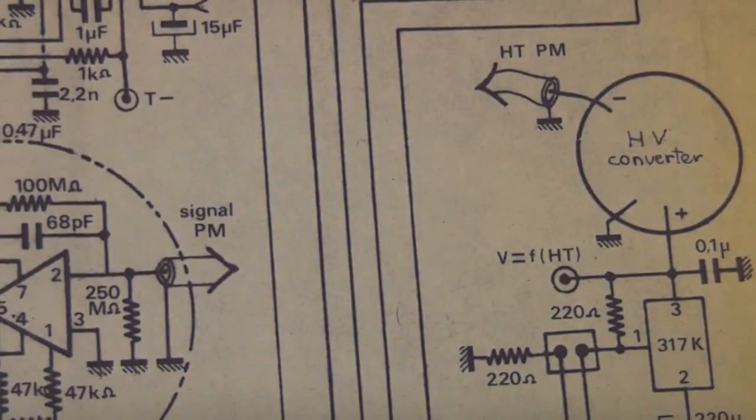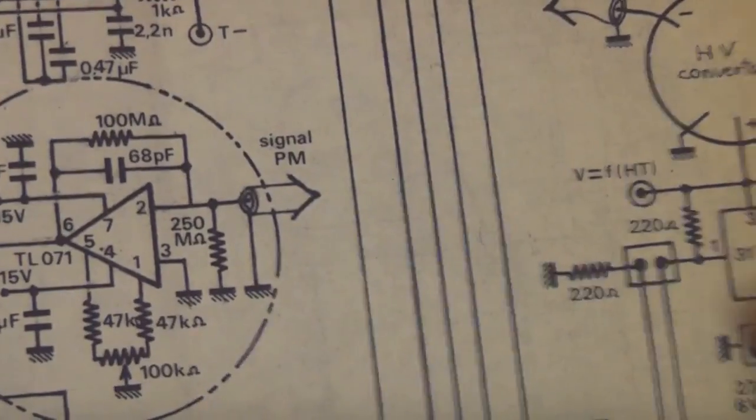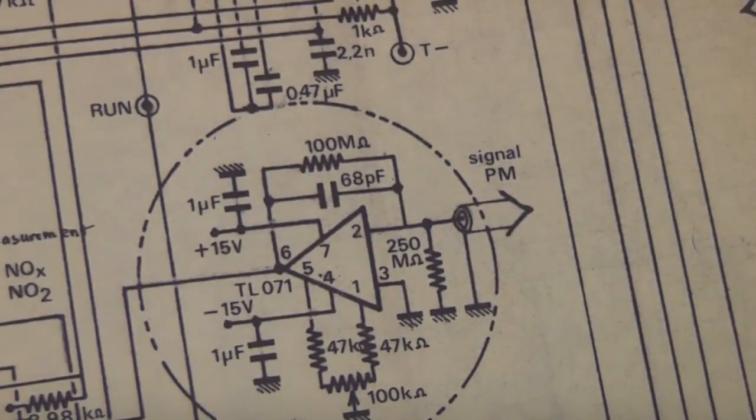It's always worth doing, if you're taking apart stuff like this that might have useful modules, to just fire it up and measure the voltages just so you know what these things are expected to be driven by. Quite often photomultipliers have a standard power supply, maybe sometimes even a standard amplifier, so those are actually quite useful modules.